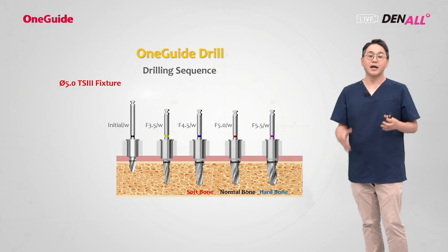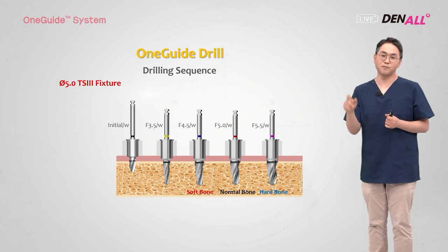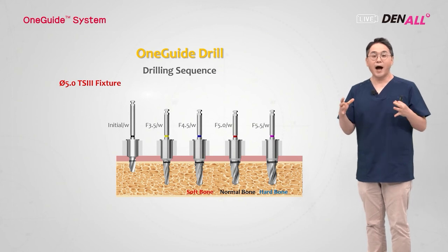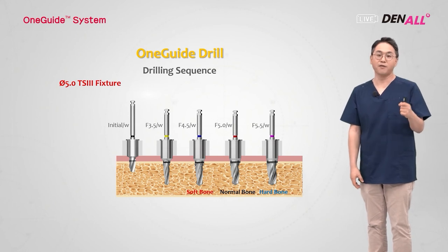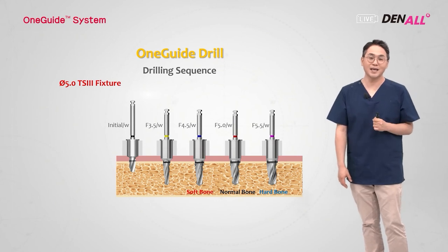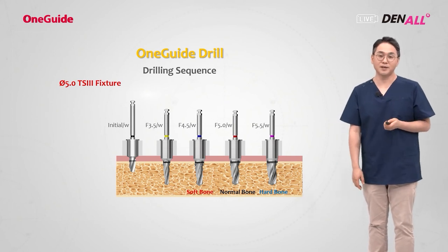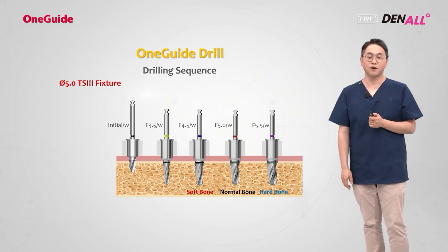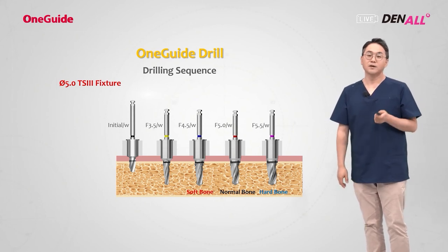When we place a 5.0 implant, a 5.8 millimeter guide hole is made. All drills should be chosen from the right side with the W mark. If you use a drill on the left side with the 5.1 guide barrel, you can do the drilling but with less accuracy, leading to angular deviations. For wide holes, drills with a W mark should be used. Initial drill, then 3.5. In soft bone, up to 4.5 drill is used before implant placement, 5.0 in normal bone, and 5.5 oversized drilling in hard bone before implant placement.